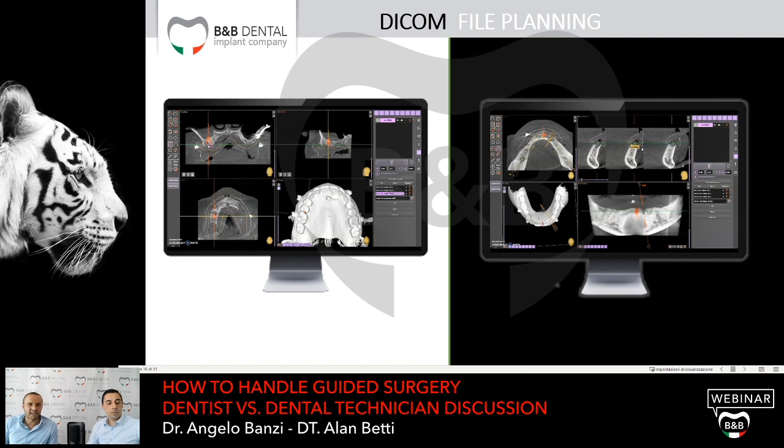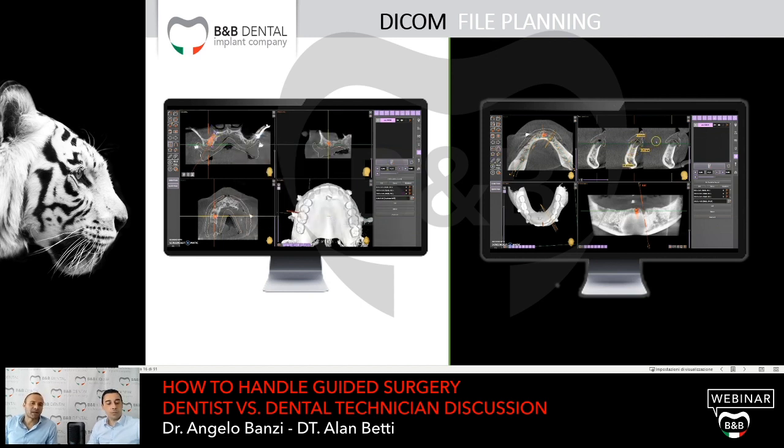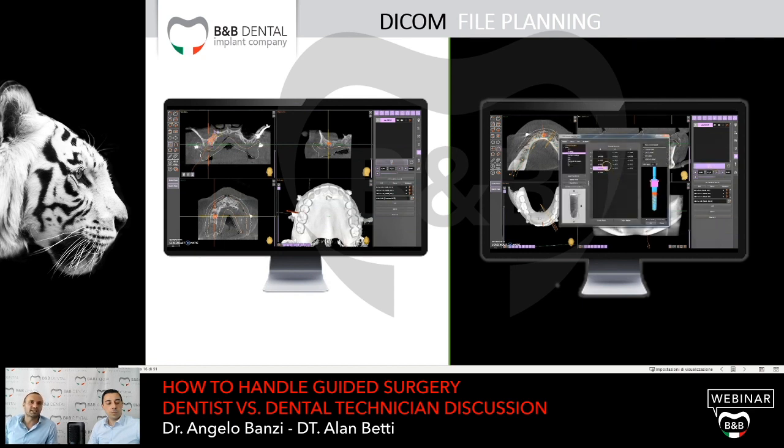Every type of fixation with the abutment requires a different position of the implant. And as you can see from this image, the fact that the radiological template has teeth helps me to understand the right position of the implant.